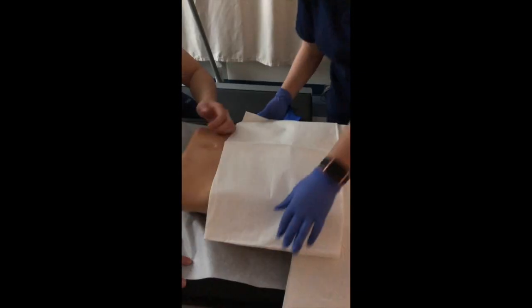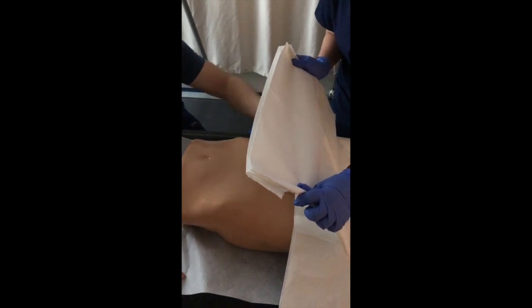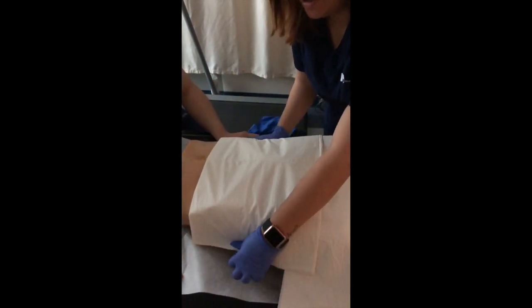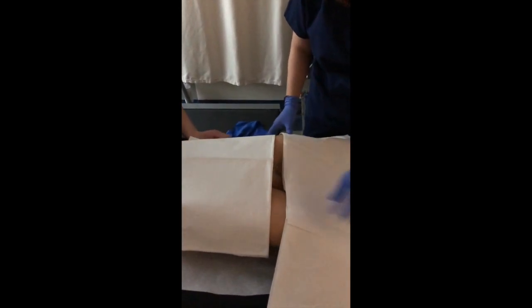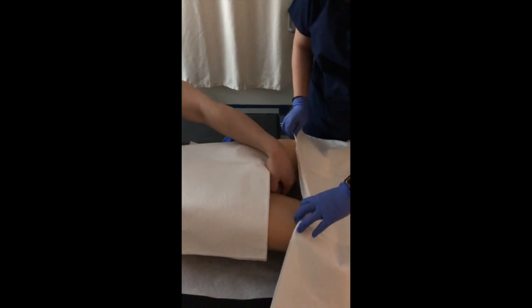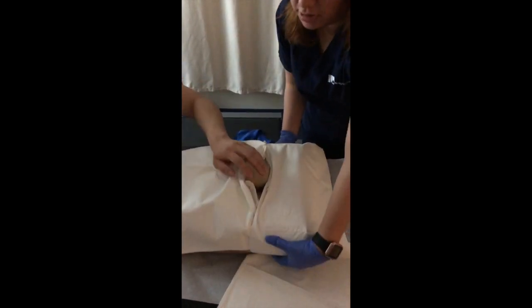Okay. Alright, Chris, I'm gonna need you to hold your penis. Lift it up towards you. Okay, that's good. And then we're gonna need to lift up your scrotum. I need you to lift up your scrotum. I'm gonna place this under for support and you can let go.